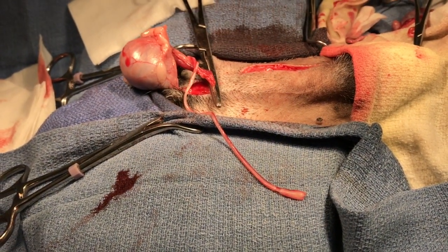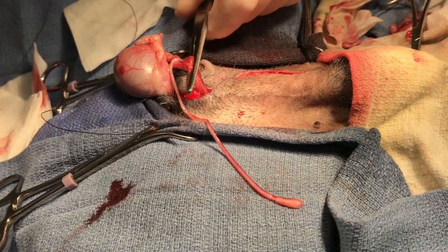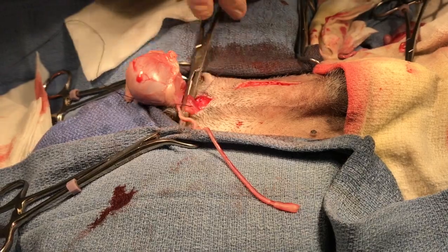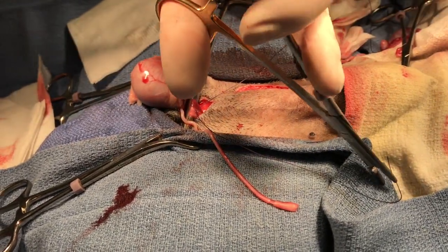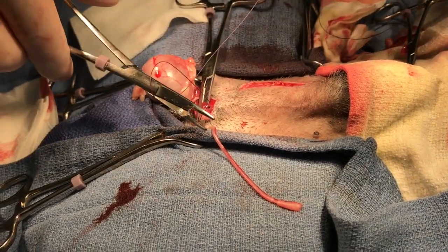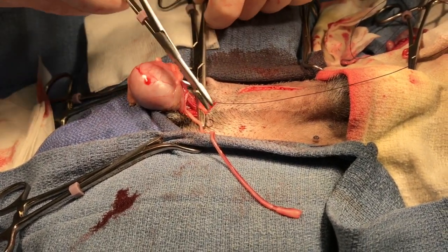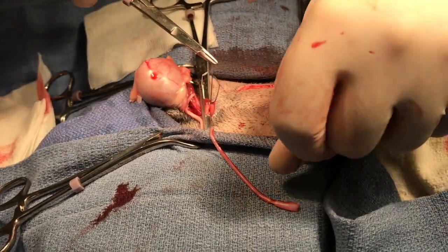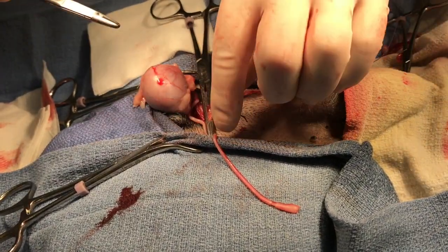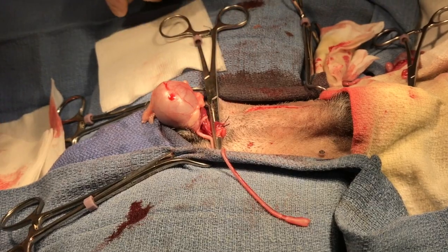And now we are going to remove the rest of the testicle by which the uterus was attached to.